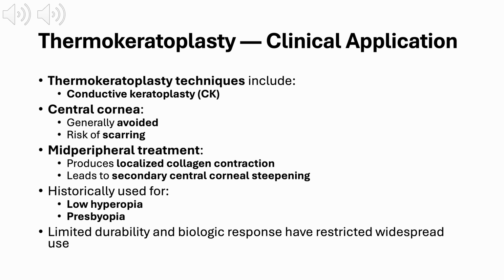Historically, this approach was used for low degrees of hyperopia and for presbyopia, particularly in patients seeking a non-ablative option. However, because the refractive effect depends on collagen behavior rather than permanent structural remodeling, durability has been limited. Over time, biologic remodeling and regression have restricted widespread long-term use of these techniques. This slide really reinforces a recurring theme in refractive surgery. Achieving an optical effect is one thing, but maintaining it in the face of corneal biology is the true challenge.